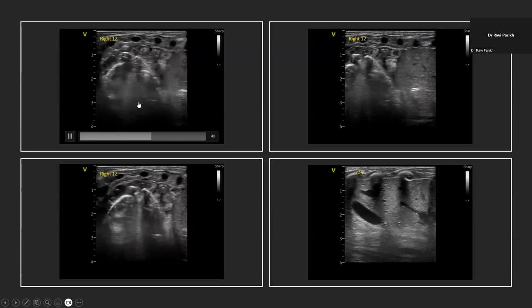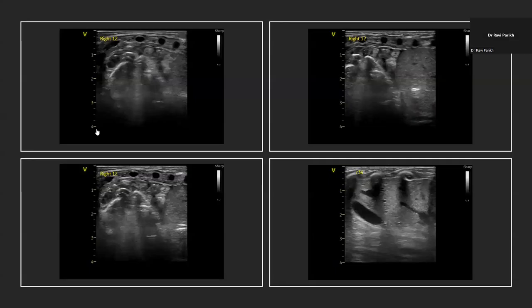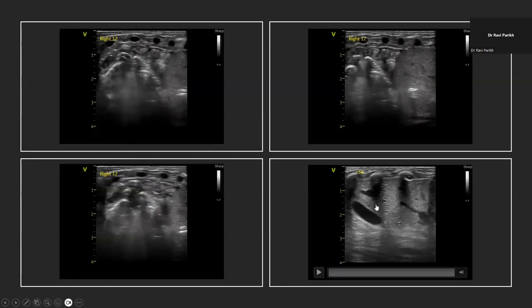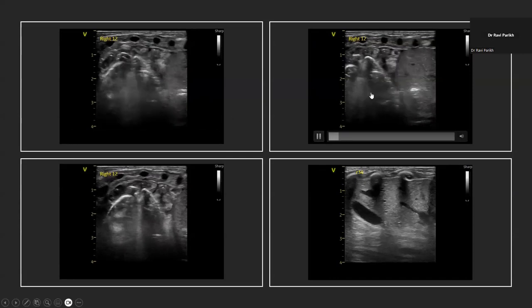What do we find? These are the intestinal loops. It's a postnatal diaphragmatic hernia. Now, this is where you have to be careful. Some people with this presentation might not hesitate to empirically needle without a chest x-ray because the baby's bradycardic. The risk of that is you might end up with a pneumothorax, you might end up with bowel perforation. It's the right side, and it's pretty high. At R1, you're seeing bowel all the way up there with lung that's pretty collapsed. It's a postnatal diagnosis, so a lung ultrasound very quickly confirmed that this was a diaphragmatic hernia.